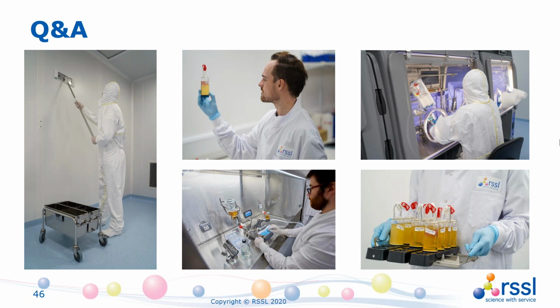Yes, it can be. I've seen people do that, where they've written position papers, shown similar characteristics and done that substitution. So yes, it is possible, and I'm aware of the challenges dealing with Bacteroides in general, getting hold of it, and that it's actually a very fastidious organism to deal with at the best of times.